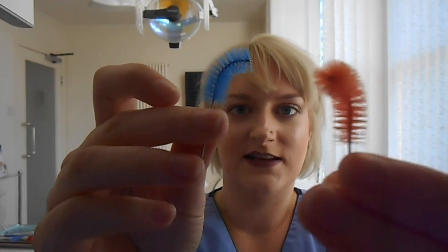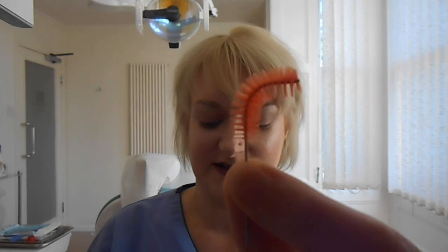So these are Vision Brushes. I'm just going to show you there, hopefully you can see. There's all different kinds of sizes. Basically you want to use the biggest size brush for the gaps in between your teeth. If you use a brush that's too small, basically it'll push food out, but it won't clean in between the teeth properly, and it won't clean the sides of the teeth, and it won't compress your gum, which sounds a bit silly, but that's what we need it to do in order to clean it effectively if you have gum disease.